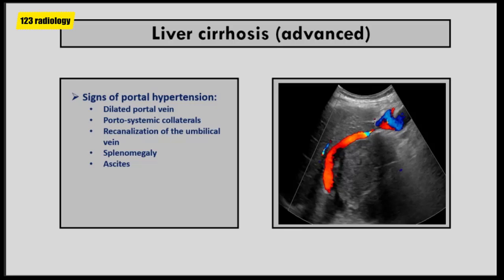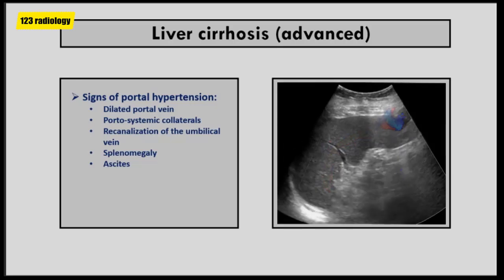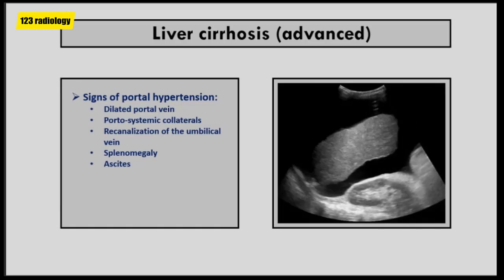Recanalization of the umbilical vein is a sign of severe portal hypertension, found in 10 to 20% of cases of advanced liver cirrhosis. The recanalized umbilical vein can be traced from the left branch of the portal vein continuing to the abdominal wall downwards towards the umbilicus. Splenomegaly is frequently seen in approximately 80% of cases of liver cirrhosis, frequently exceeding 15 cm in bipolar diameter. Ascites is frequently encountered in patients with decompensated liver cirrhosis, and ultrasound is a very sensitive method to detect it.